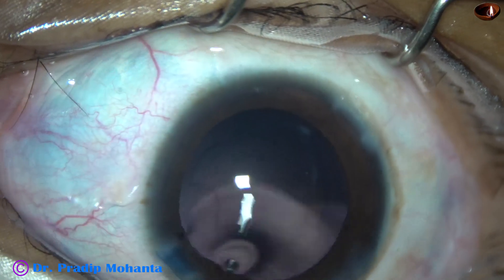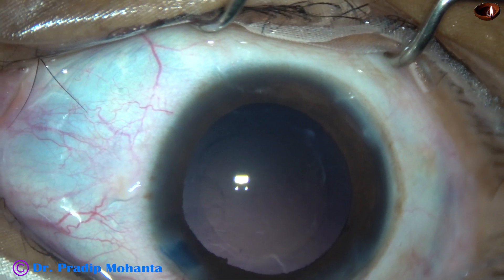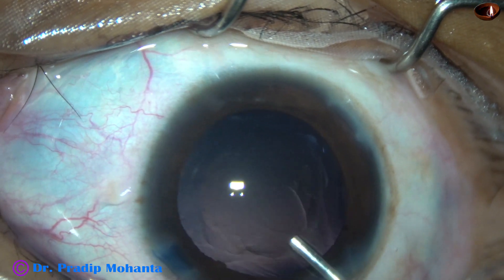At this time, we can see that the staining from the corneal endothelium has almost gone off.